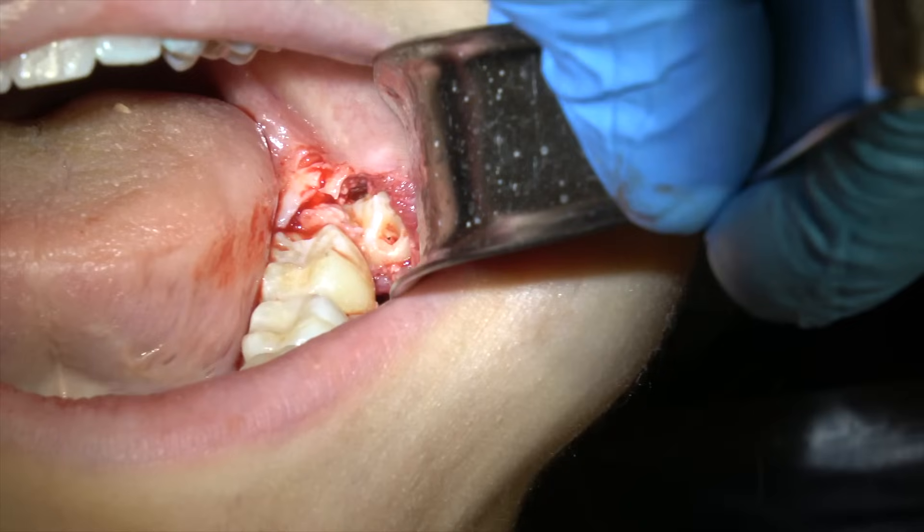And now if you've cut all the way through the tooth, you can elevate the mesial aspect of the tooth into that space and the distal part of the tooth into the space. If you don't cut all the way through to the furcation though, you don't have a complete space to elevate into and it will bind in the part of the tooth close to the furcation. It won't be able to move freely.